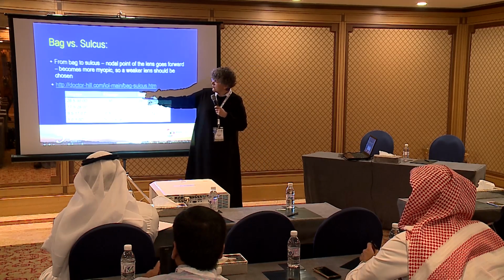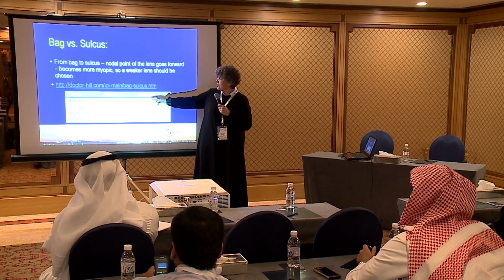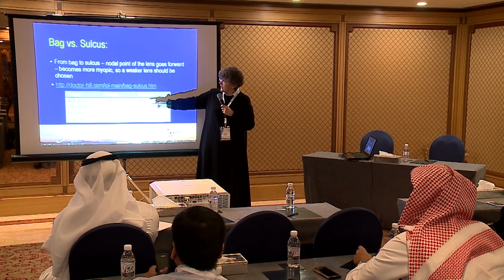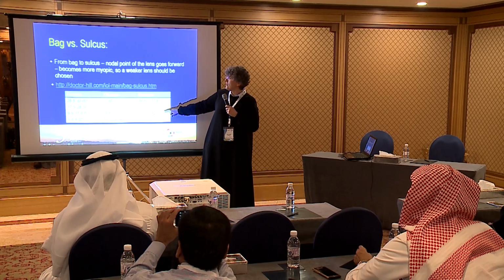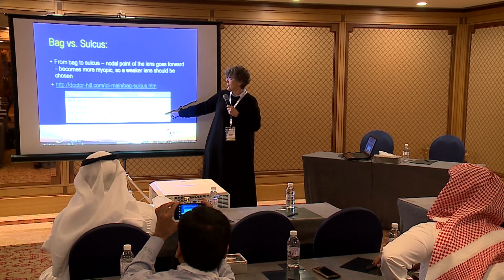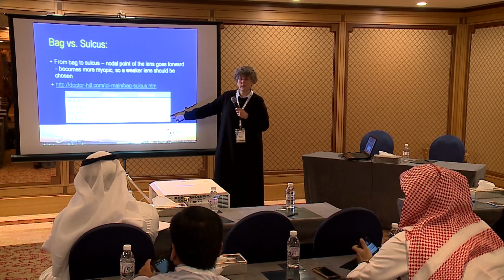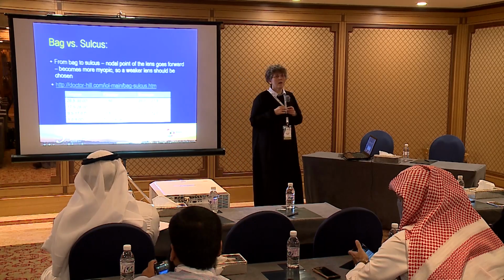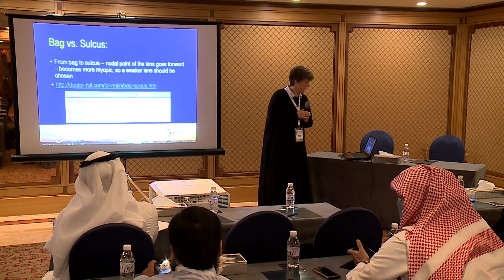I put in an example. You're taking a lens of 29 and the eye is very short, so you change it by 1.5, you go to 27.5. And if it's a slightly less shorter eye, you'll change it by 1 diopter. And if it's a myopic eye, you will change it only by half a diopter. And if it's a highly myopic eye, don't change it because it won't have a big effect. Okay? So the shorter the eye is, the higher your correction should be. And there is no calculator for this. This is common sense, think and do. Okay?